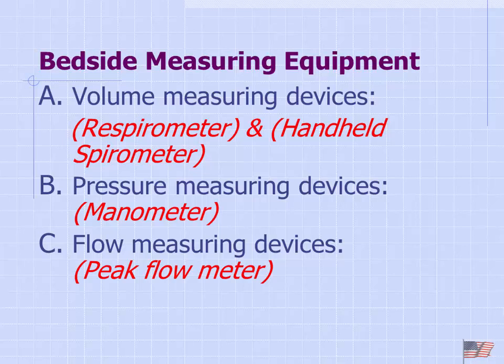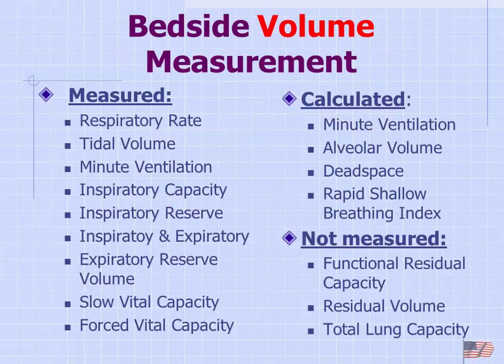So what about the bedside? What can we end up doing? Typically, a pulmonary function is something that's done on an outpatient basis as far as simple spirometry. But we can do some stuff at the patient's bedside.